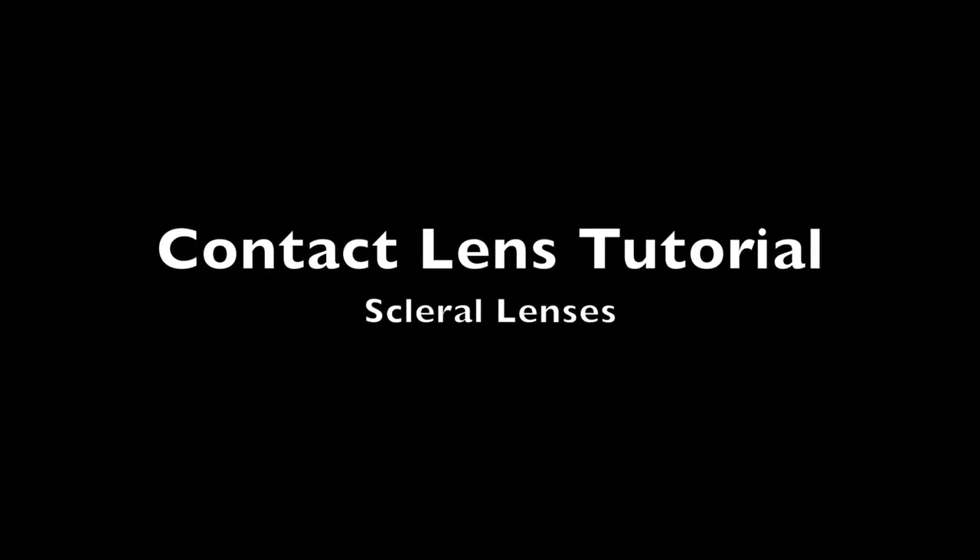This video is designed for the instruction of insertion, removal, and care for your new scleral lenses.